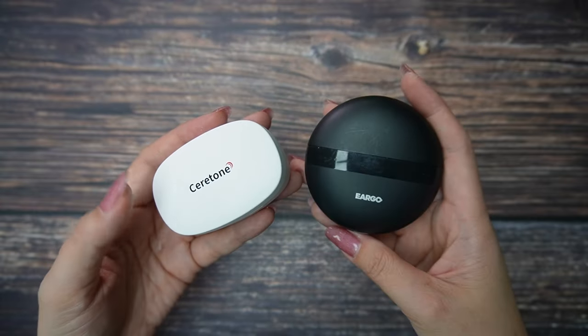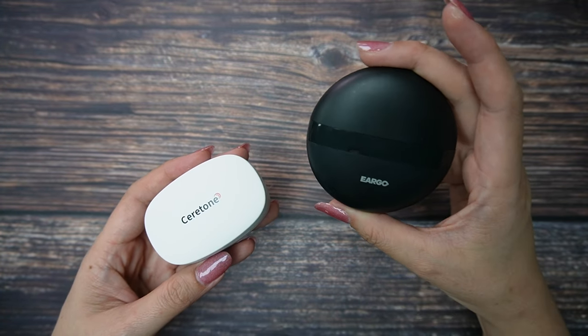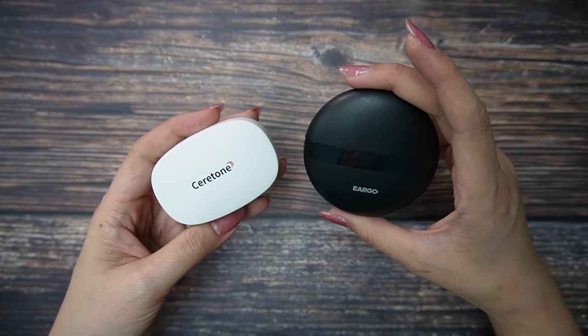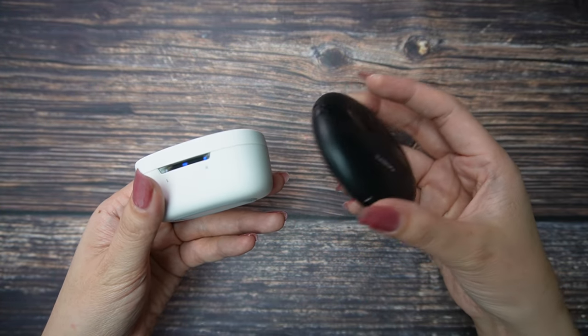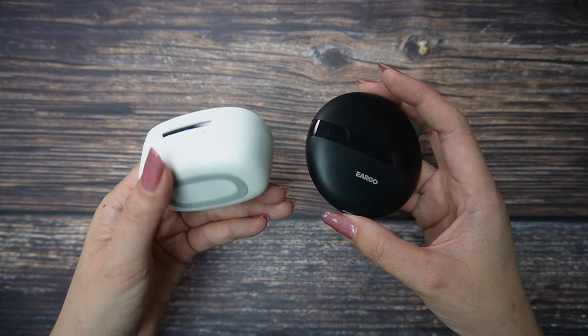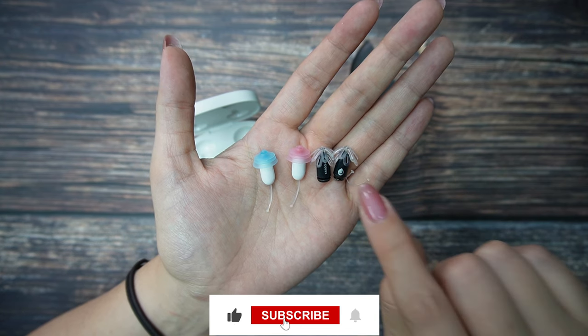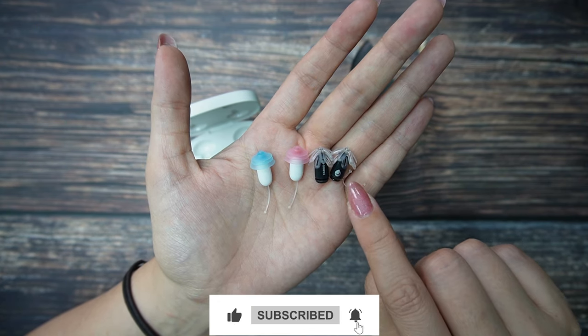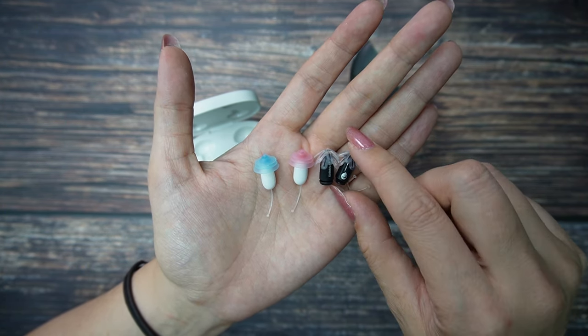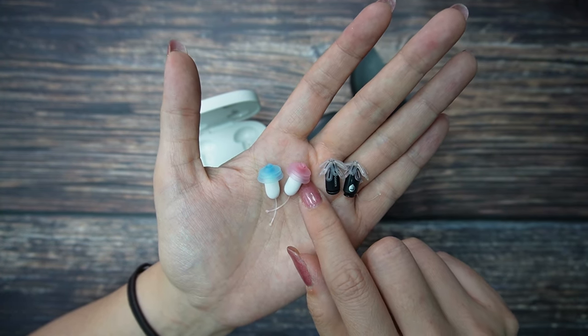Now let's check Eargo 6 and Core One side by side so I can give my opinion. For the design, Eargo 6 is more elongated while Core One is a little more fat — I think this comes down to personal preference. The hearing aids themselves are almost the same size. But for side indication, with Eargo 6 you need to read letters on the sides, while with Core One you can easily recognize them by color.